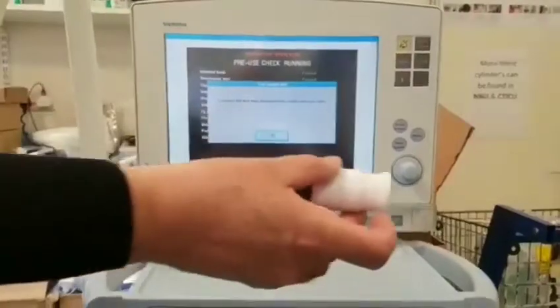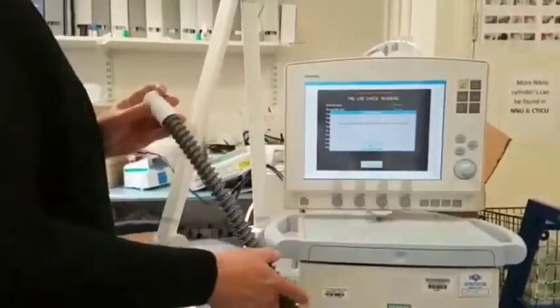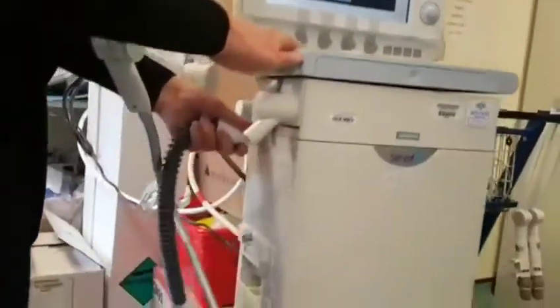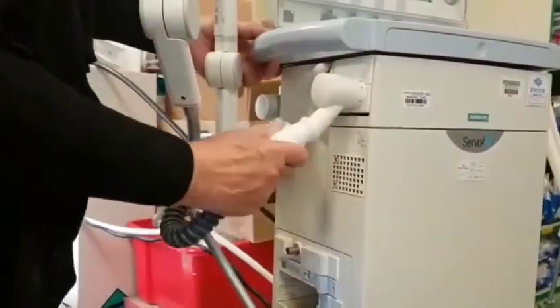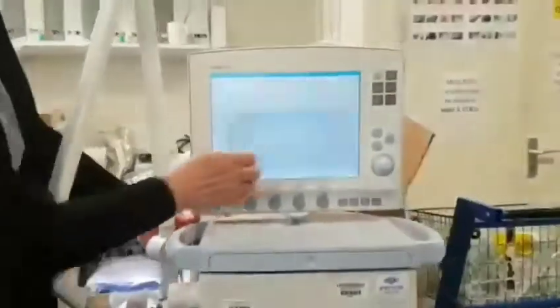You will need to use this, which is the test tube — the same one as we used on the ServoEye. It's asking me to connect the test tube between the inspiratory port here and the expiratory port here. When I've done that I can say OK on screen.